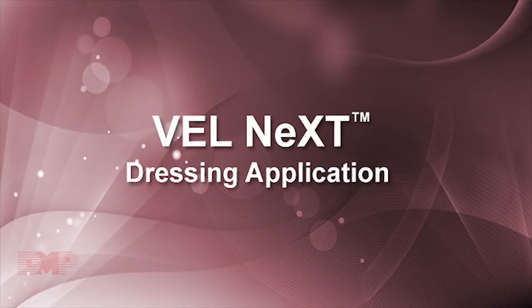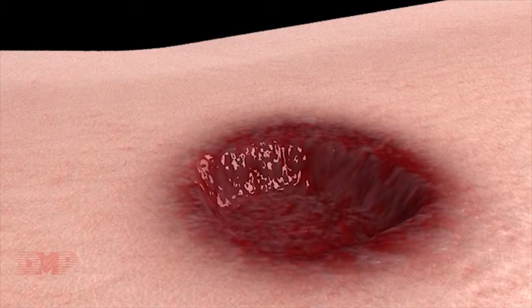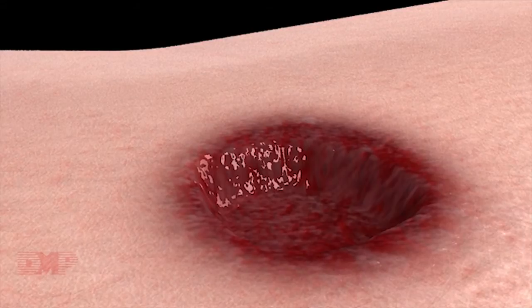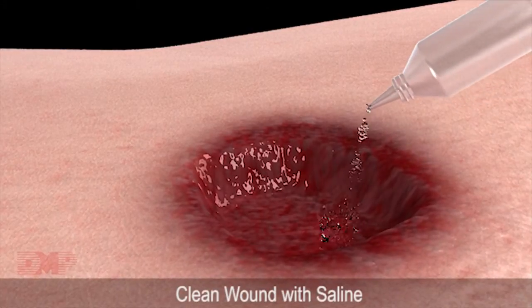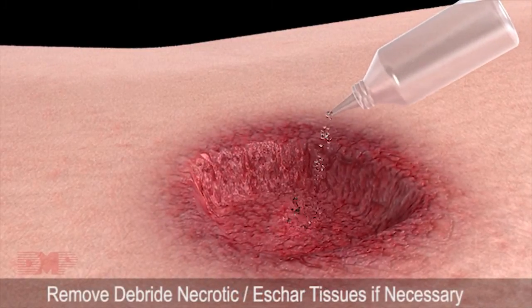Velnext Dressing Application. Wounds may be different in shape and sizes. Prior to use of Velnext Therapy, clean the wound with saline or as per the hospital's guidelines and debride necrotic eschar tissues if necessary.